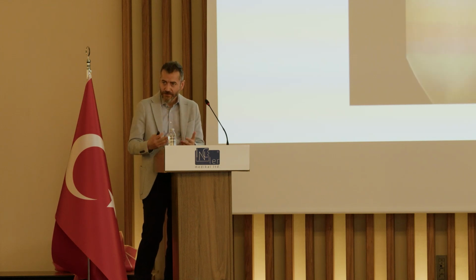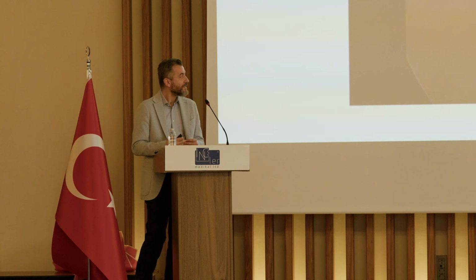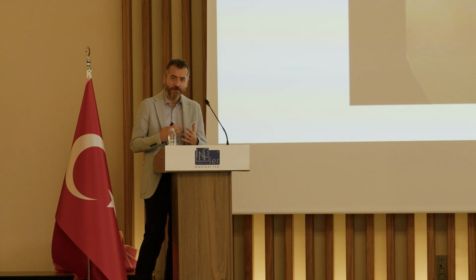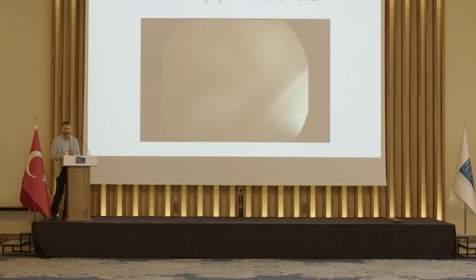After a simple education, you can do it. And also, sometimes the probes are used a lot of times, which means the efficiency will not be good. If you have some problem, first of all, just try to replace the probe, and then it can become much more effective. So in the end, as I said, you need to know how to operate it.